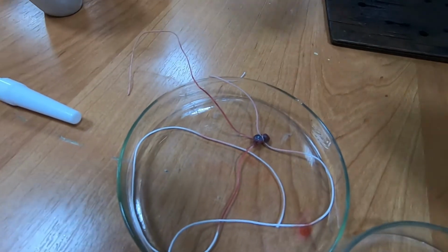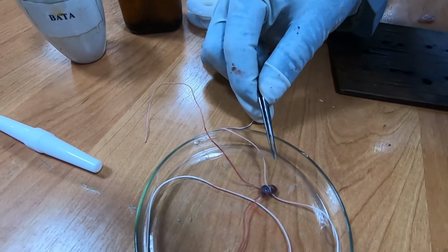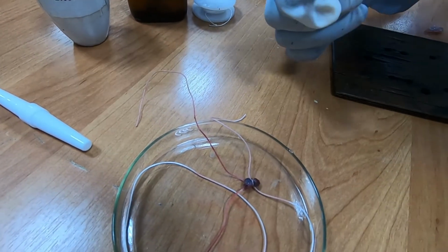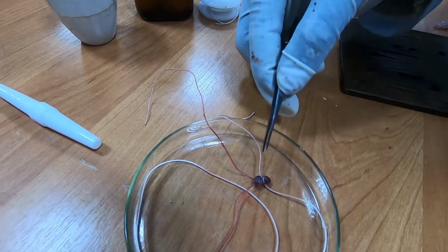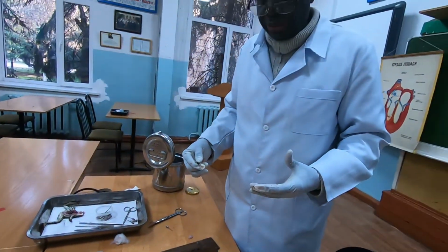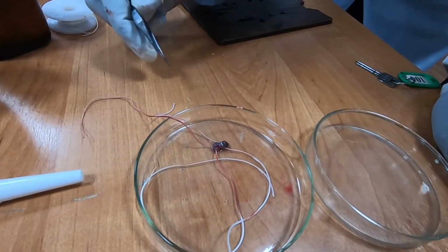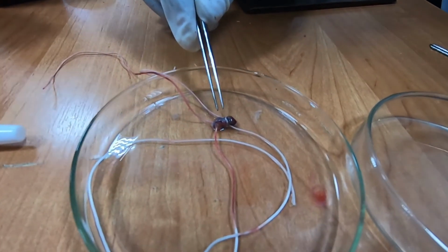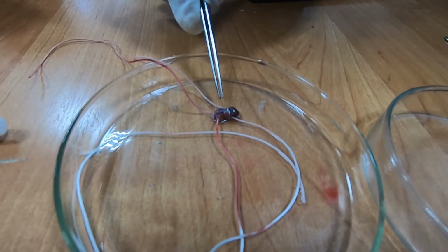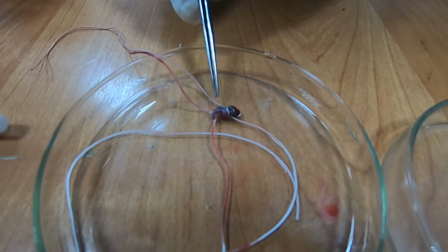So this is to tell you how heart transplant is done, how hearts are removed from one organism to another and even taken to other continents, countries, and so on and so forth. You can see it is still beating. If we add adrenaline now, you will see how it is beating much, much better. I will show you now. You see the heartbeat is being restored because we have added some adrenaline. Now it's regaining its heartbeat.